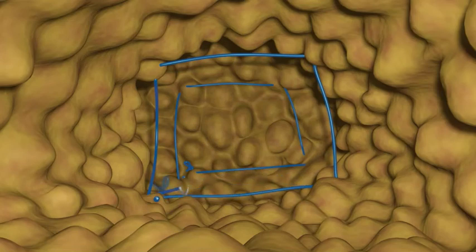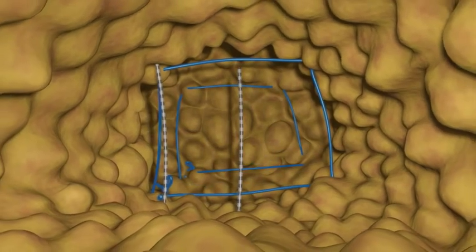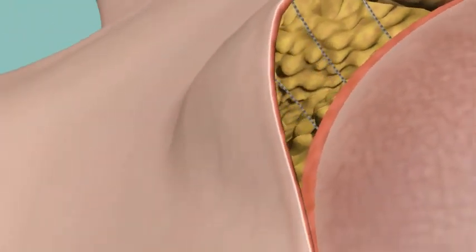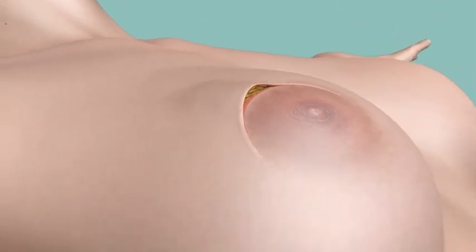Once the lumpectomy has been marked with a VeraForm, you simply close the breast in the usual fashion, reapproximating tissues as appropriate.